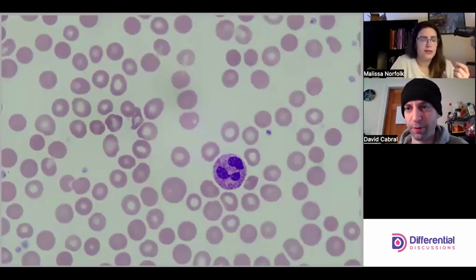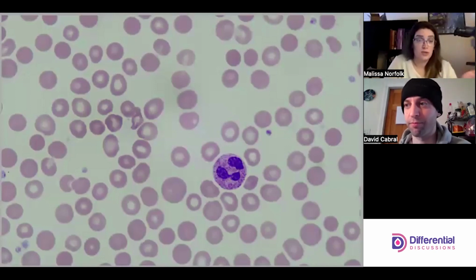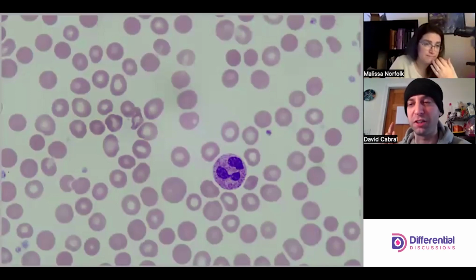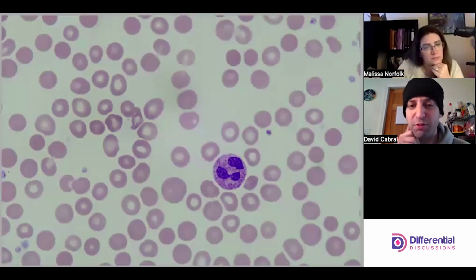So manufacturers have manufactured G-CSF so that we can give it to patients, either neutropenic patients, or patients where we're trying to stimulate the push out of the marrow to gather the other cells as well. Depending on what's happening with the patient, you can use G-CSF. That would be for an autologous transfusion? I don't think it's always autologous, but yes, if you're trying to collect immature cells, stem cells, things like that. Really cool procedure.